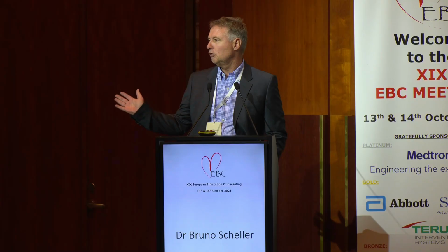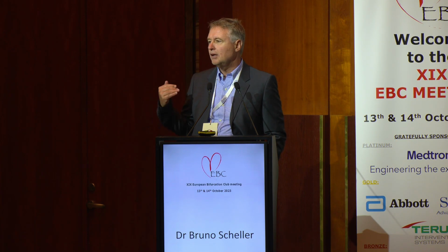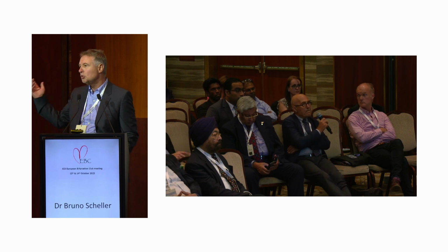It depends on the result. I mean, the experience is that the side branch gets better over time. And this means you can accept in this situation not the recommended maximum of 30% we propose, but it's only fine if you have the 50% stenosis. It will look better over time.